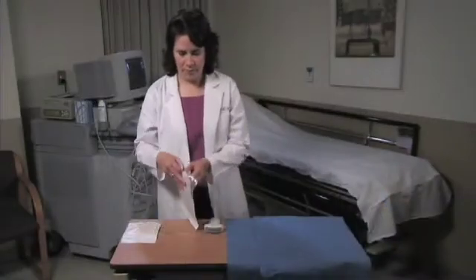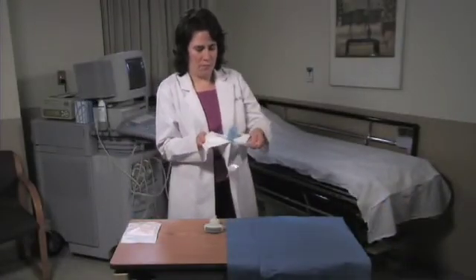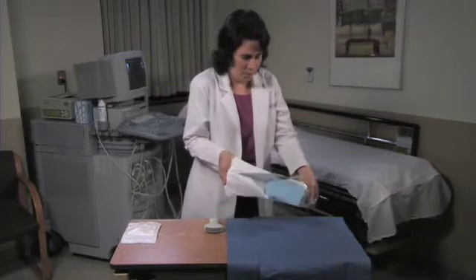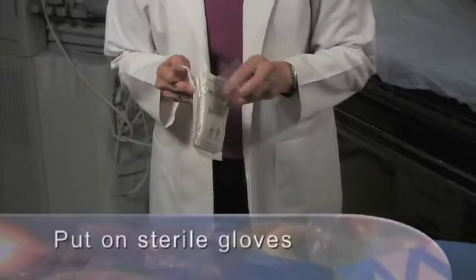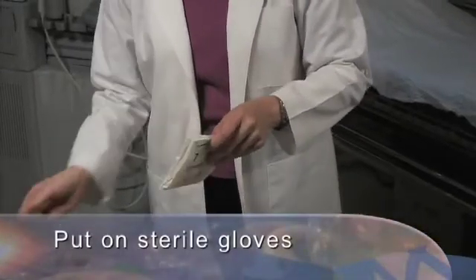First, establish a sterile field by opening a sterile drape or procedure kit. Next, drop the cover and other contents of the pack onto the sterile field. Next, put on sterile gloves using standard technique.